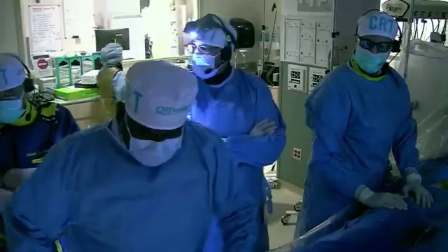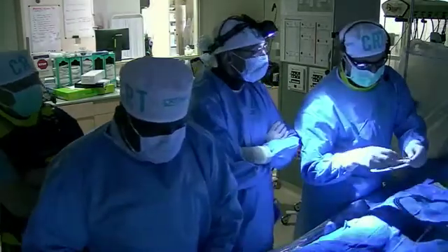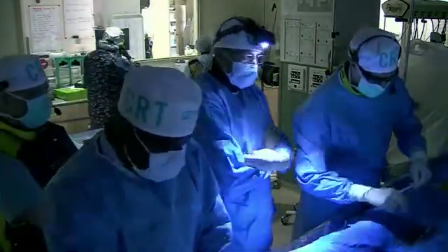So Richard, between orbital and rota, what would you choose? Can we give 1000 of IV heparin, please? When I have nodular lesions, I usually go to CSI. I have many examples of just giving it a haircut and shaving. So Rich, have you been using CSI?